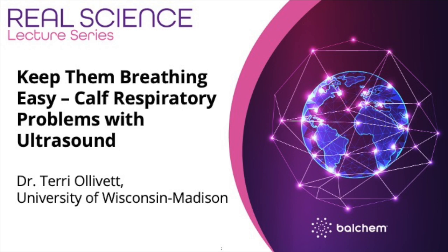Yes, if you get a calf treated when they're a score 2, they are much less likely to become a score 3 calf. And that's the best treatment response we get, when we can get them treated at a score 2, so 1 centimeter or more.